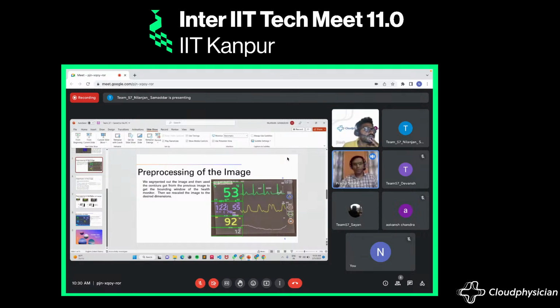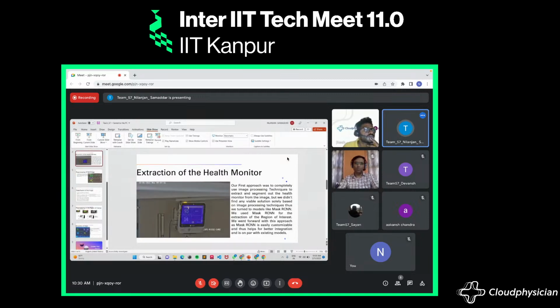For perspective transformation, you need to know the coordinates to correct the tilt. How are you getting those coordinates? How are you predicting those? Actually, we are approximately trying to get the coordinates. For the previous example here, we manually did this. Here the monitor is segmented.